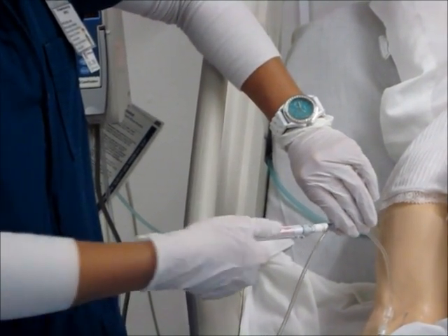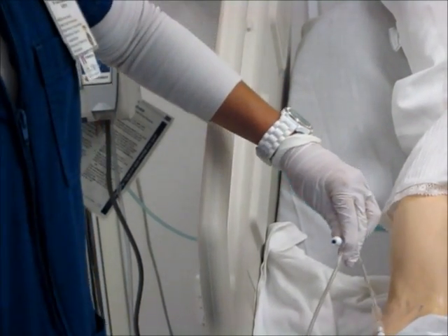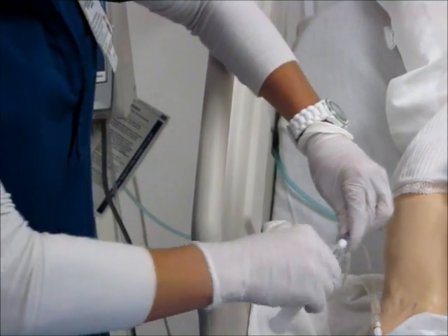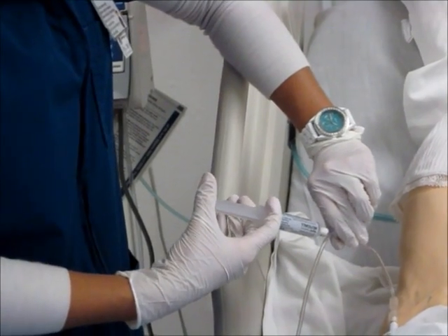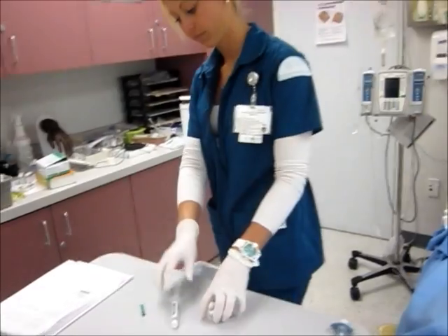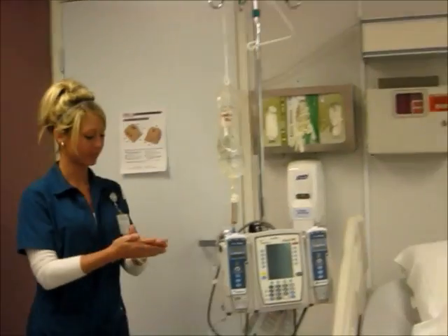Once administration of the medication is complete, the nurse will disconnect the medication syringe and attach another 10 cc saline syringe to do another saline flush. She will be monitoring the patient's response to this as well and note the flow of the saline. Once complete, the nurse will dispose of all the syringes, remove her gloves, and perform hand hygiene.